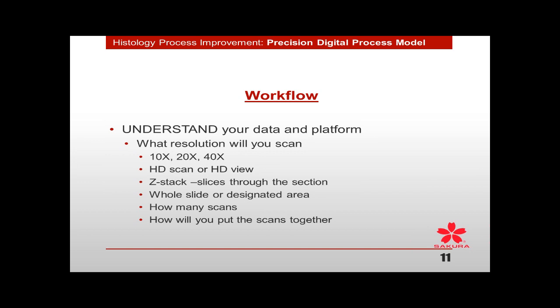Now that we've decided how we're going to scan, how many scans? Is it going to be one slide, or multiple designated areas? Who's going to pick those? Are there going to be certain protocols up front? Is it going to be automated, with an algorithm built into the software that does an automatic selection, or will pathologists choose? Now you've given scans to the pathologist, and they decide they want something rescanned, or they want specific areas. Somebody has to manage that part too and get it back to them efficiently.